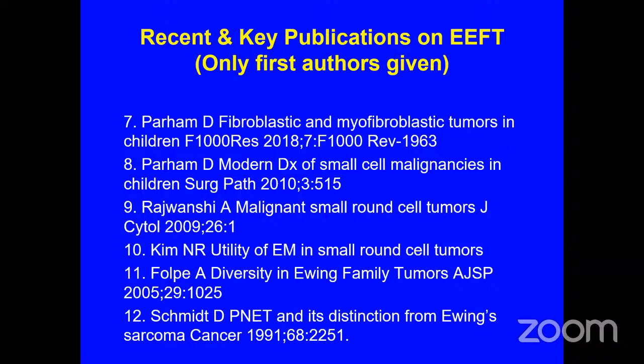Yeah. Well, firstly, the major difference is histologic. Ewing sarcoma of the kidney will consist of uniform, small round cells which are evenly spaced, and will show very little stroma, very few blood vessels, and low mitotic activity. So the histologic picture is completely different from clear cell sarcoma of the kidney, which, as I have already emphasized, consists of four basic elements: the round cells, called the cord cells, which may be arranged in cords or nests, the spindle cells or septal cells, which form septa, the myxoid stroma, and the chicken wire capillary network.